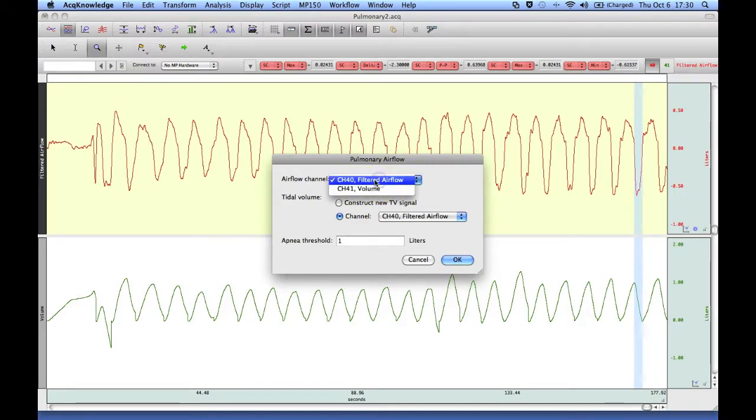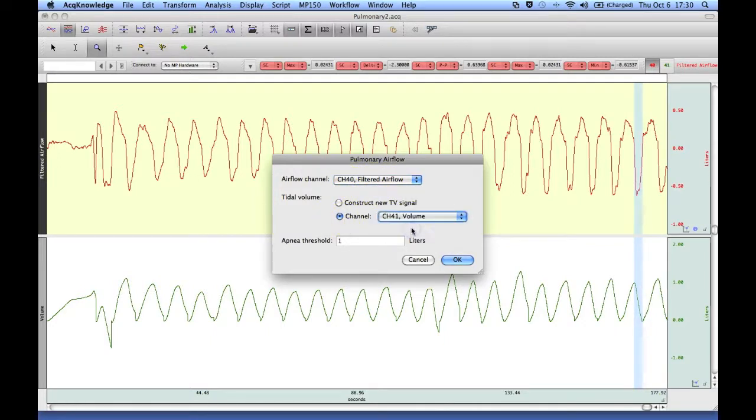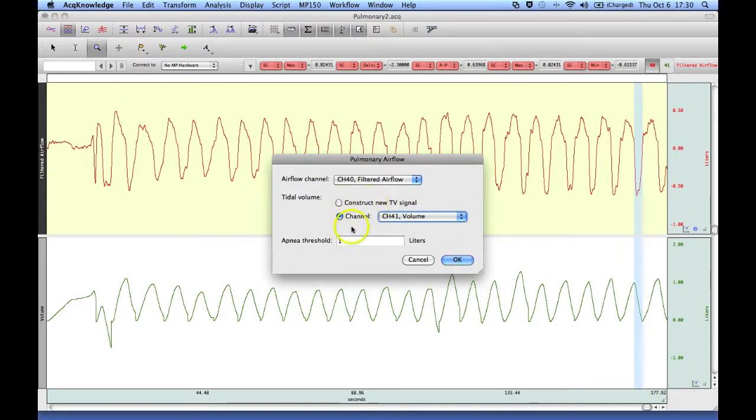So we've got a filtered airflow channel, and we've already constructed a volume channel down below. We could construct a new one, but we've already got one in our file.